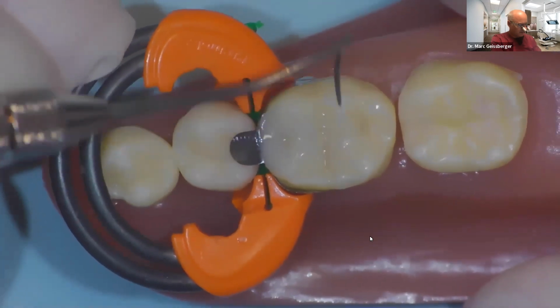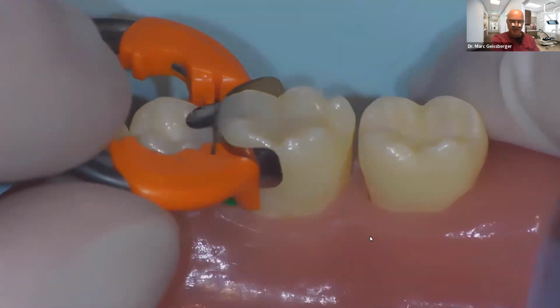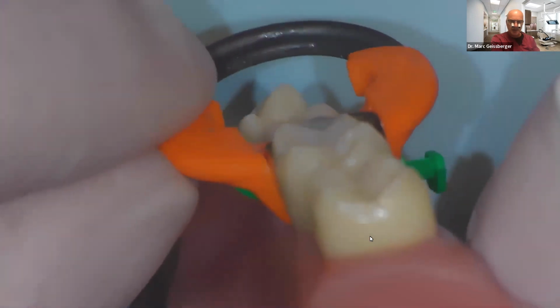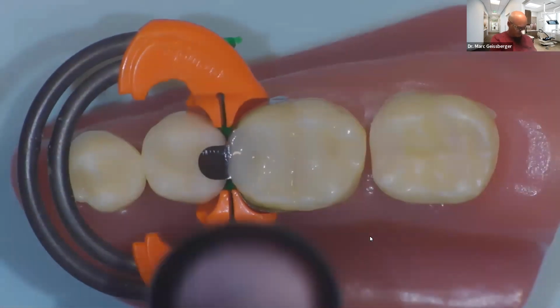There we go, bevel that just a bit. I love using this. And now you can see, oh my gosh, look at that, triangular ridges. And it's not one big flat bowl. So I haven't cured yet, but I'm trying to show you that this is all done very quickly. Now I want to cure to maximize that conversion of composite.